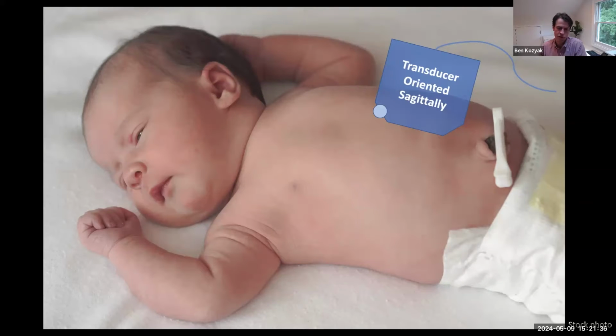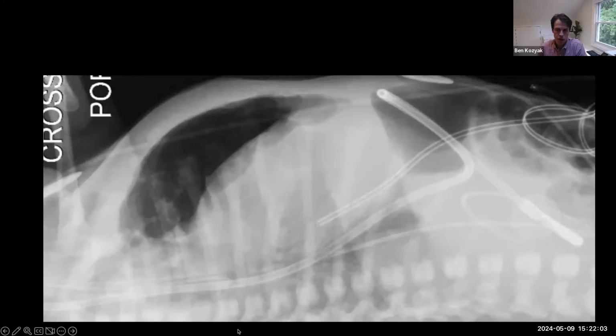And I encourage you, as you're trying to get started with this, to just practice imaging umbilical venous catheters that are already in situ around your unit, because then you get a sense for the muscle memory, and it's easier to get the views you want when you're trying to do this procedure with ultrasound guidance. So I think really just take a few minutes with each patient to try to make small adjustments and get the window you want. Each kid's a little different.